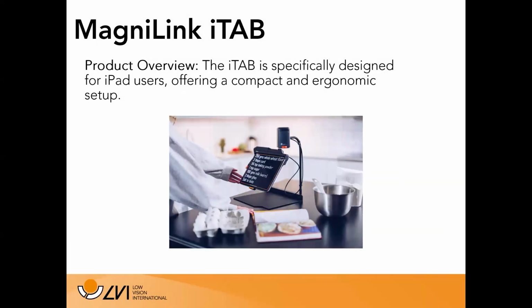The first product of the five I want to discuss that we use with our iPads is called the Magnilink iTab. So the Magnilink iTab is specifically designed for iPad users, and it has a compact and ergonomic stand, and we'll tell you about some of the features of this product.